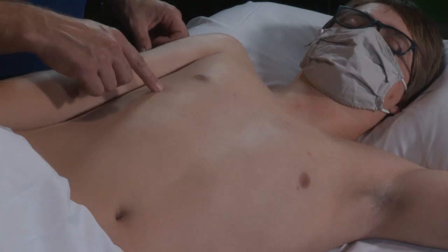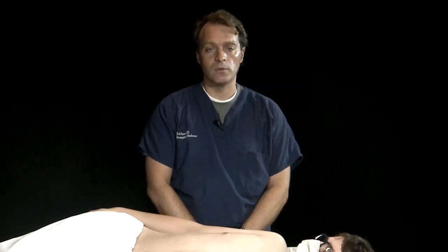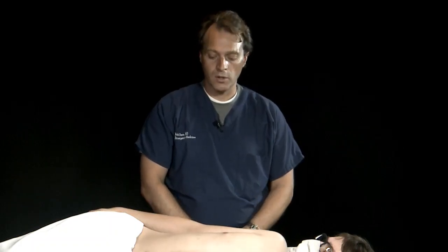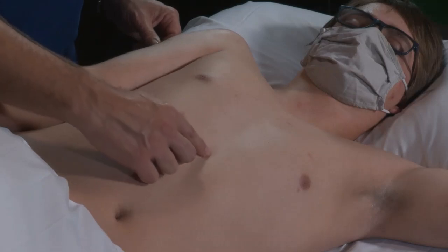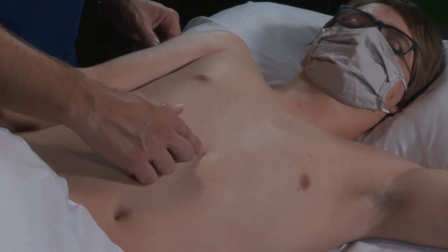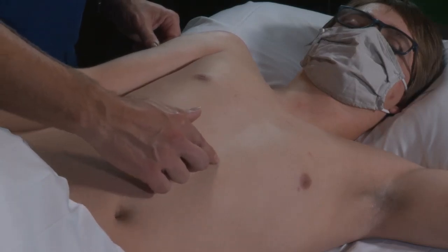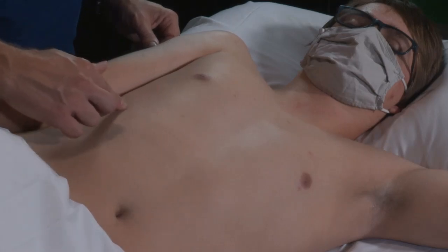Next, we'll be ready for our subcostal windows. For our subcostal windows, we're going to place the transducer immediately inferior to the xiphoid process. The marker dot is going to be pointed towards the patient's right flank.